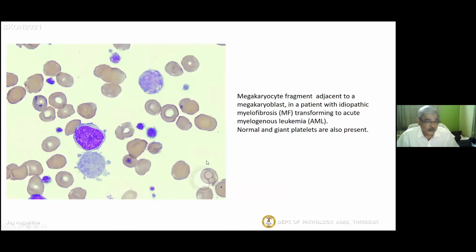So most likely this must be a chronic myeloproliferative disorder transforming to an acute leukemia. So that's how we put things together and come to a diagnosis. Of course, this is a very subjective science, but however, you can do it most of the time.